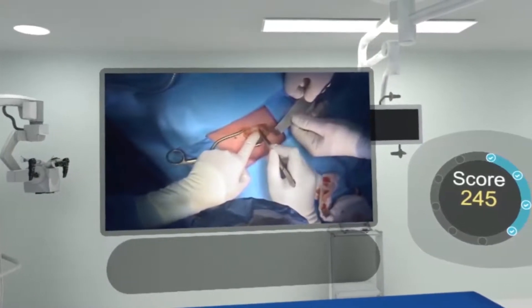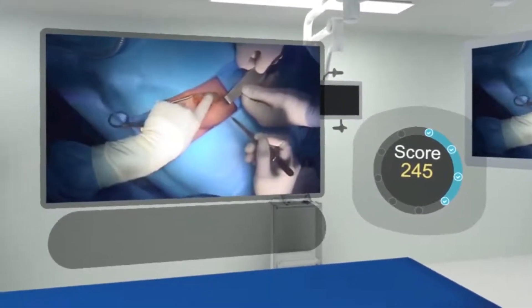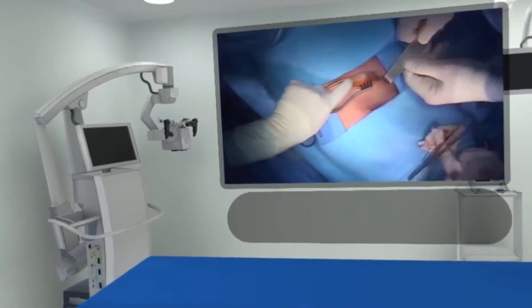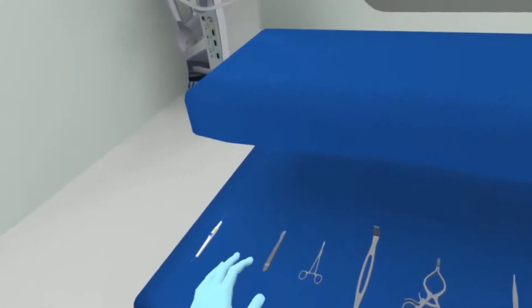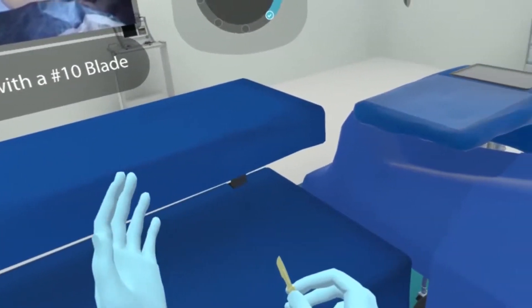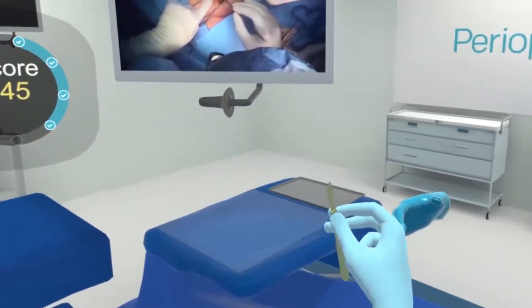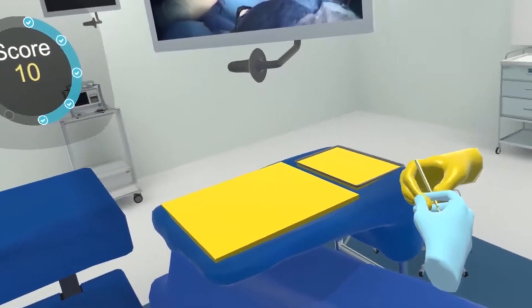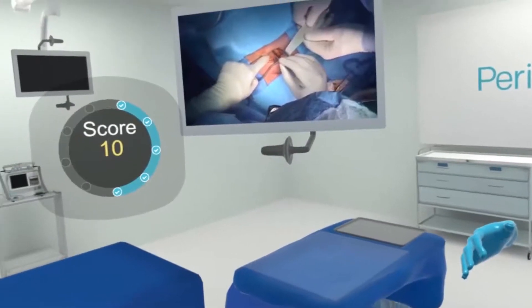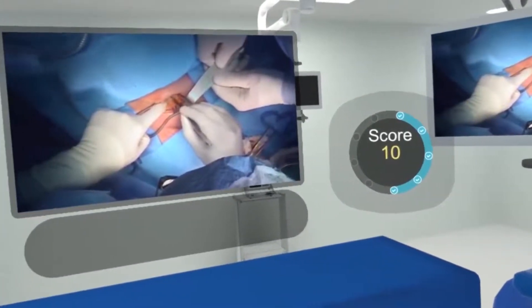We are now cutting through the external oblique muscles. Number three scalpel with number 10 blade. This one I'm going to hand directly to the surgeon's hand, so it should be incorrect. You can see how it turned yellow — it's the correct instrument, but because I handed it directly to his hand.